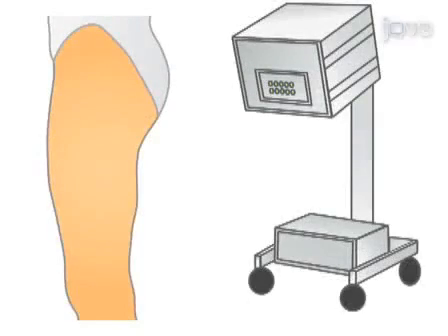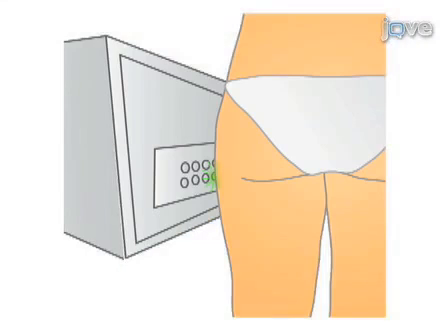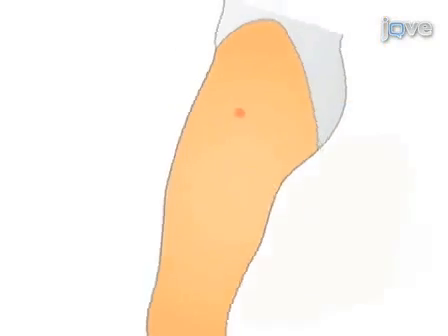This video begins 24 hours after the induction of the experimental sunburn on the thigh of a patient using a calibrated UV light source. After application of local anesthetic, a microdialysis catheter is inserted between the cutis and subcutis and is then pulled through the skin.